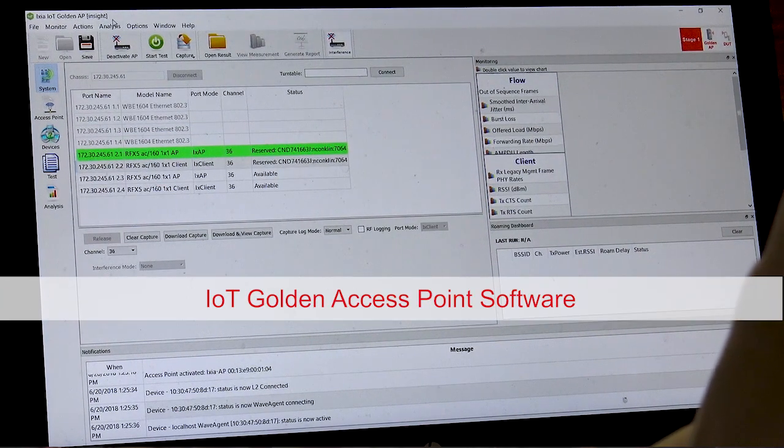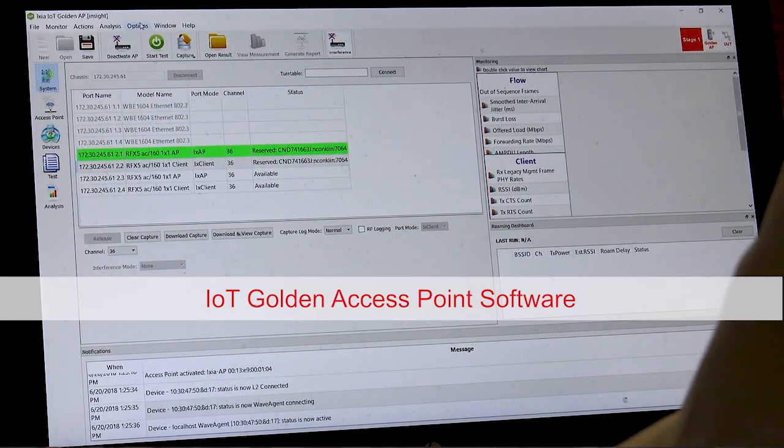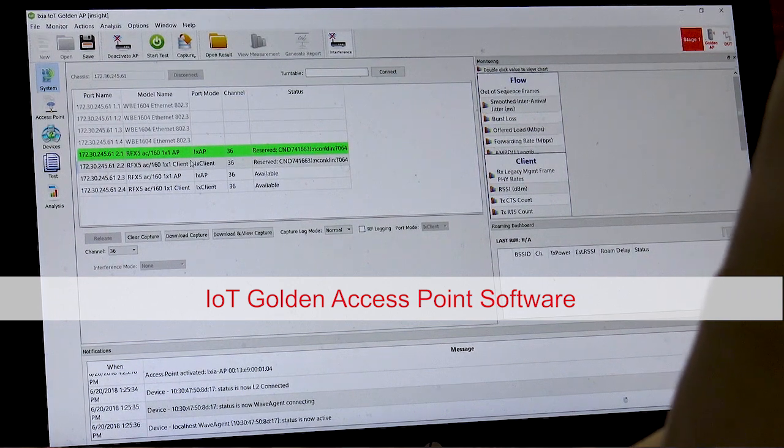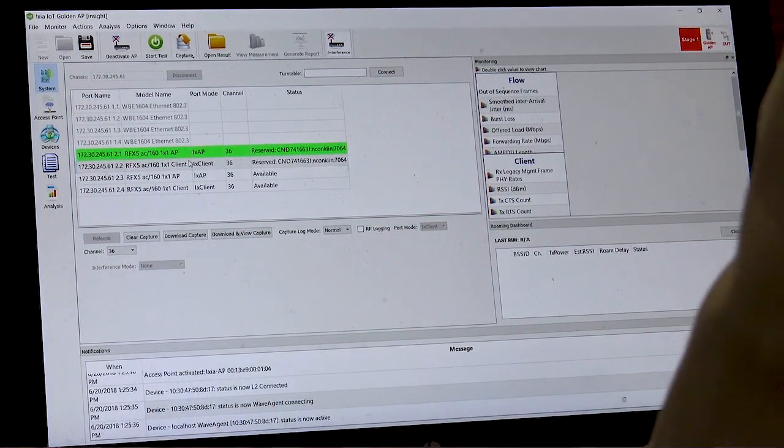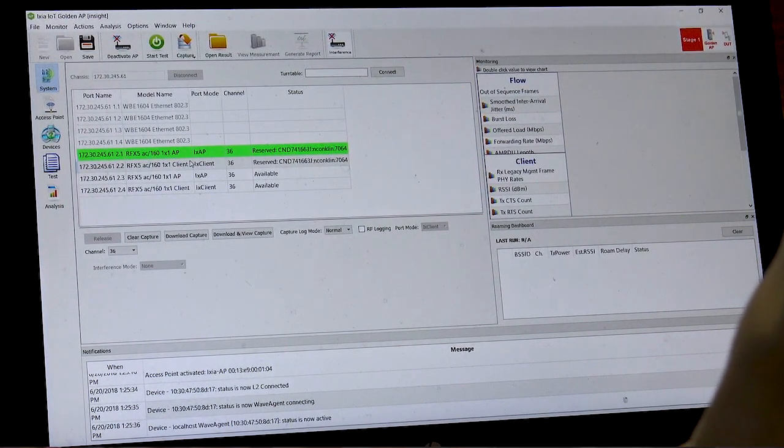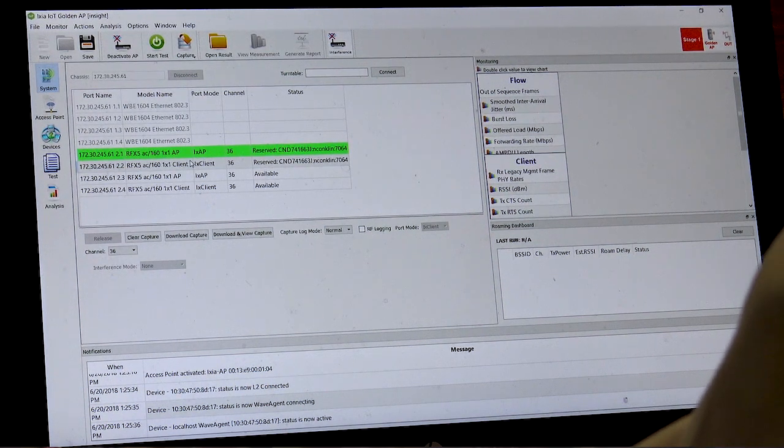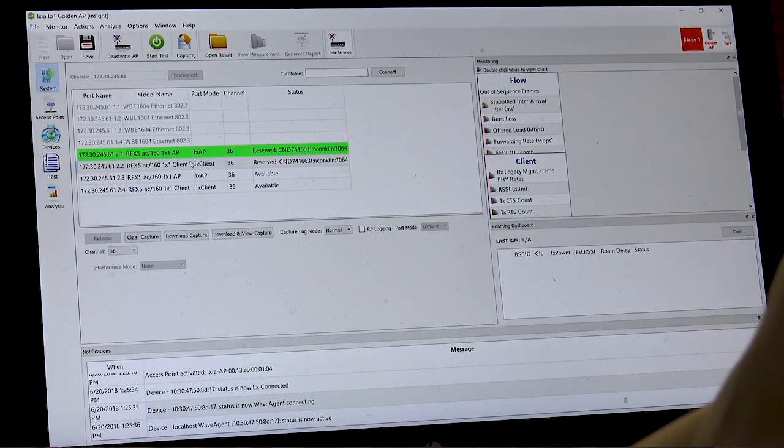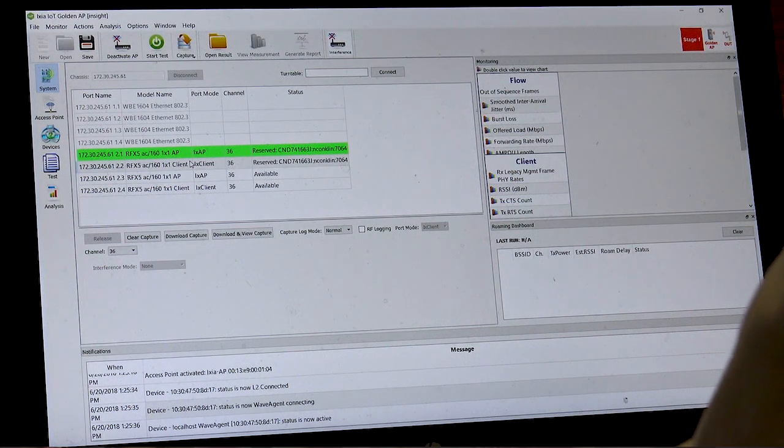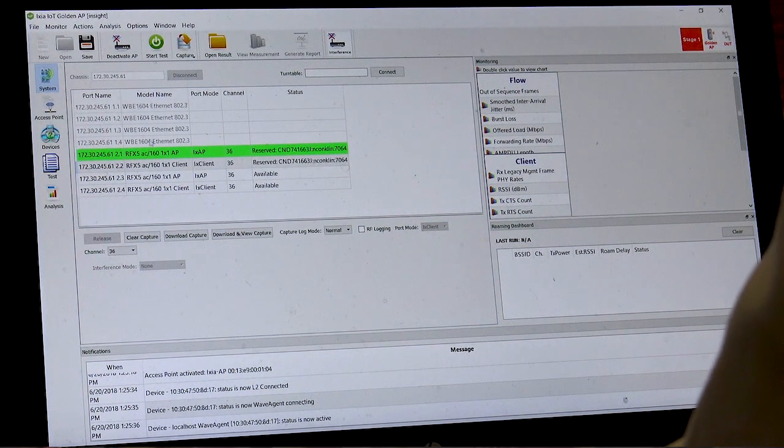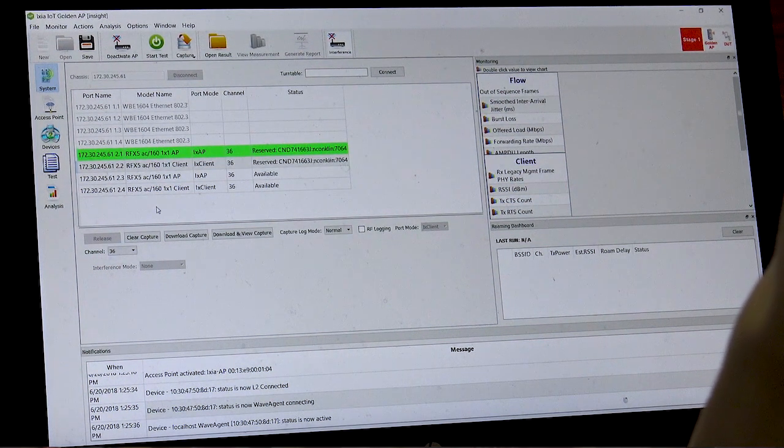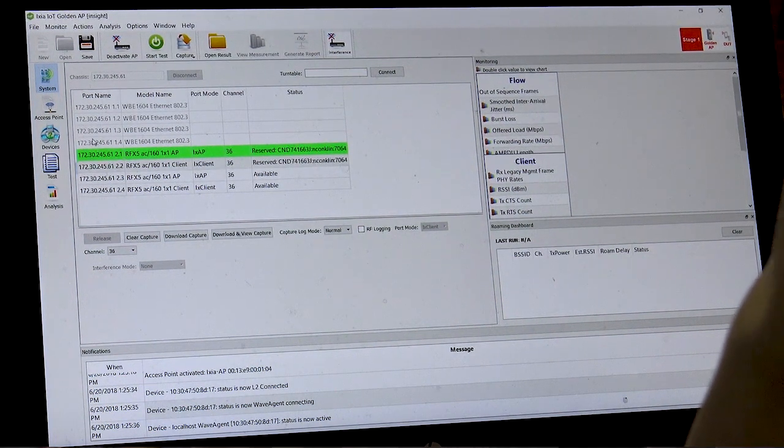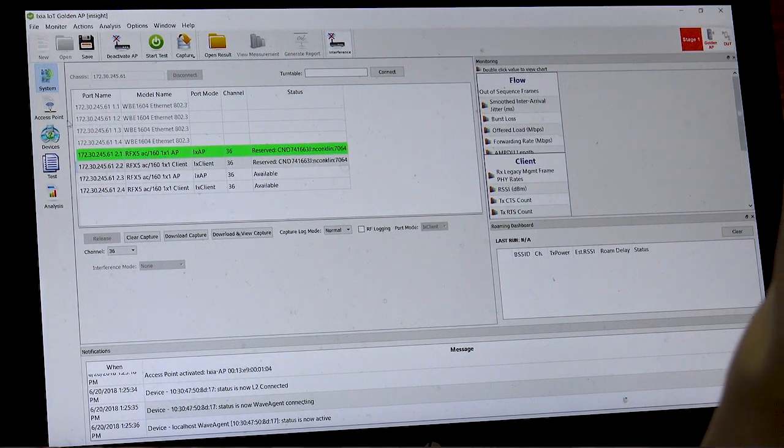This is the iXia IoT golden access point software. We use this software to reserve the ports and operate the golden access points as well as the competing wireless clients that simulate the hospital environment. We can connect to the wave test system and then choose the channel which the device will operate on.